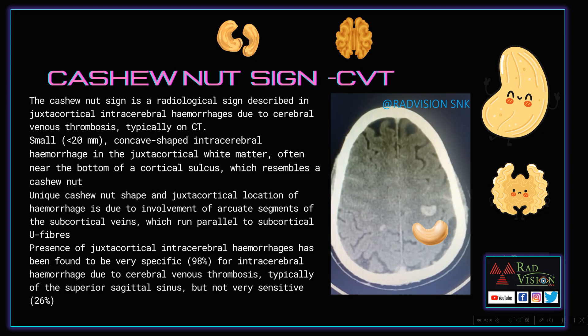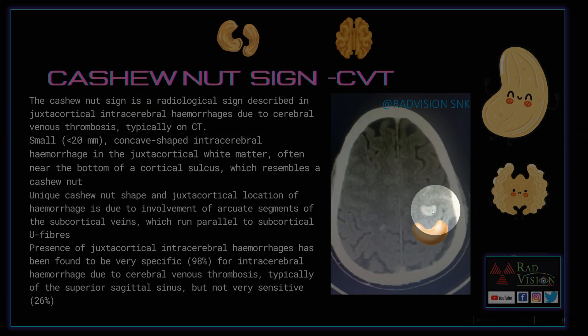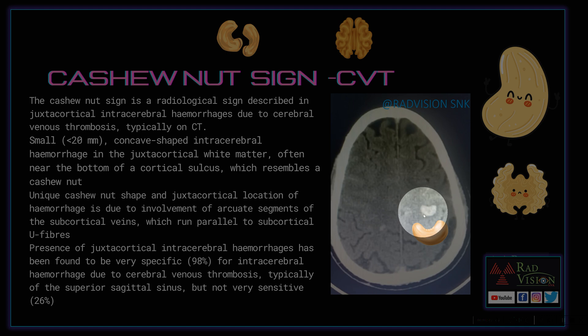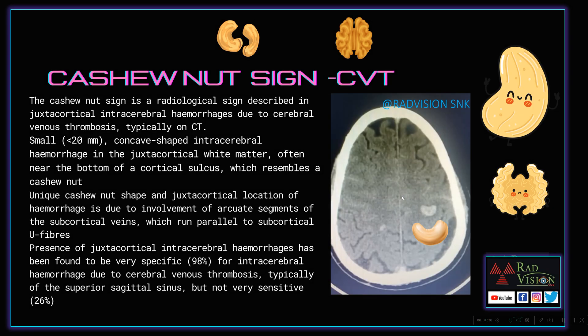Next case. Here you can see there is a small concave-shaped hemorrhage noted in the juxtacortical white matter, less than 20 mm in size. This typically mimics a cashew nut. Suspect cerebral venous thrombosis. These cashew nut shapes are typically due to involvement of arcuate segments of the subcortical veins which run parallel to the subcortical U-fibers.